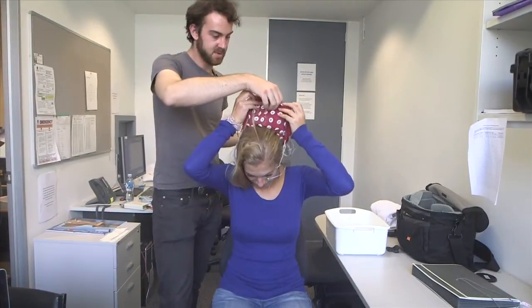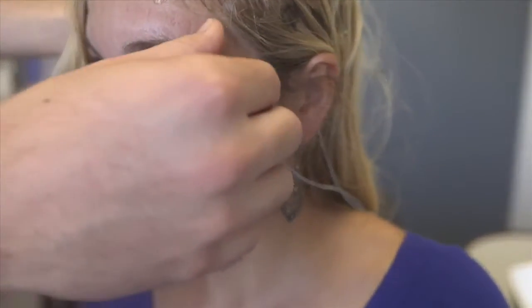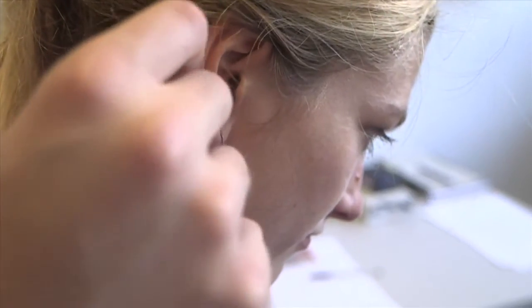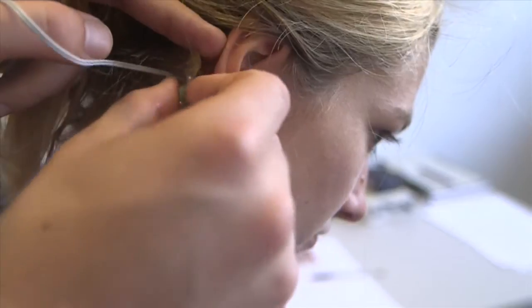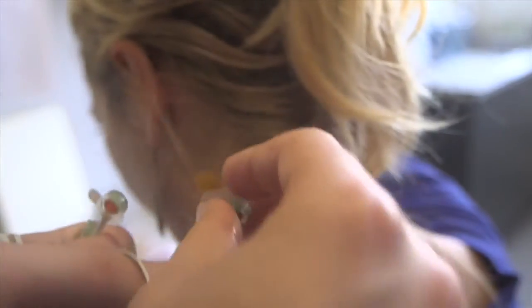The first step is to carefully remove the cap from the participant's head, and then peel off the external electrodes. Never pull on the cables to do this. Instead, grab the head of the electrodes or use the little flap on the adhesive rings. Also, be careful not to pull your participant's hair.